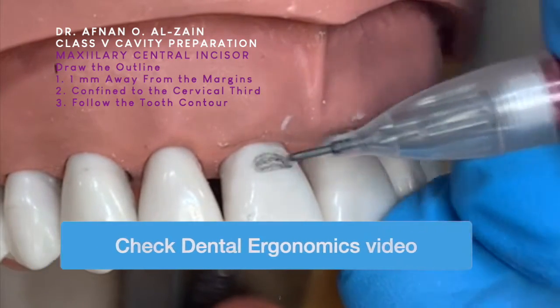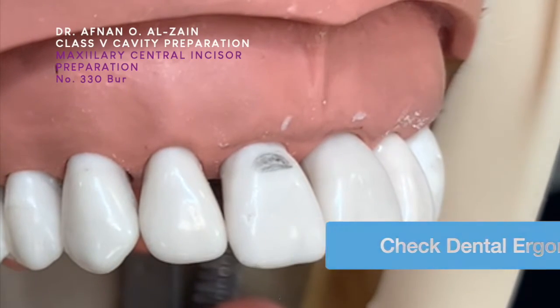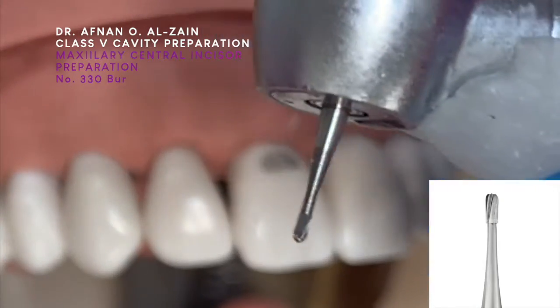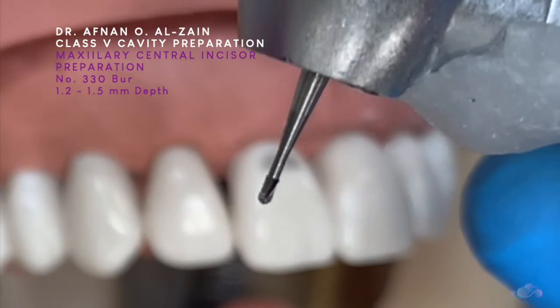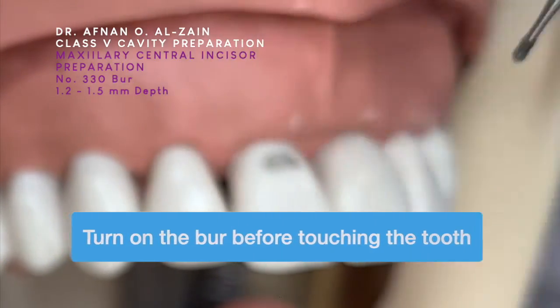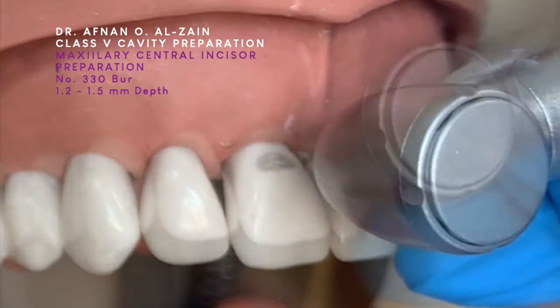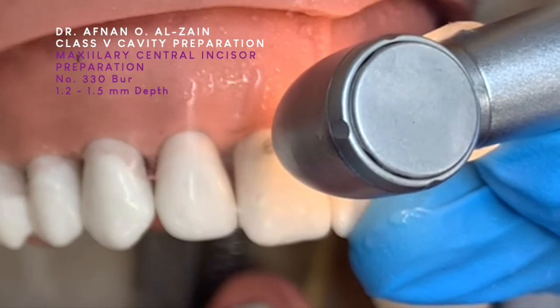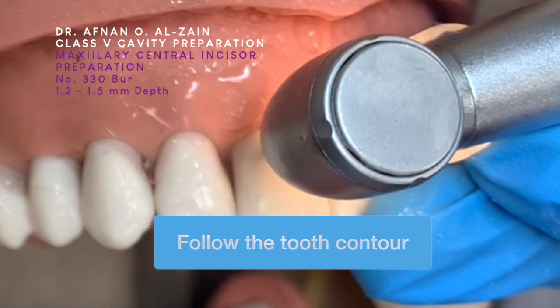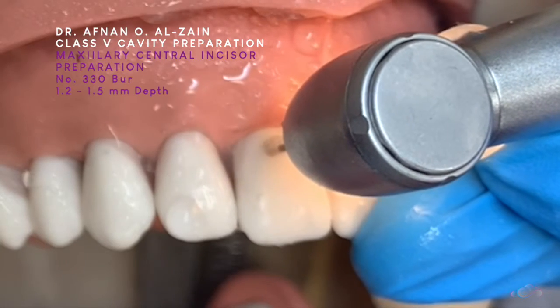So, 1 mm away from the gingival margin and from the proximal. We're going to use a 330 bur to prepare the class 5. We're going to go perpendicular to the surface and then start preparing the cavity. The important thing is to make the preparation for class 5 is to follow the contour of the tooth.